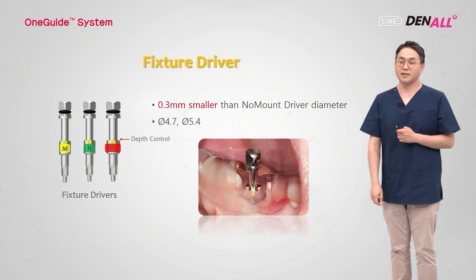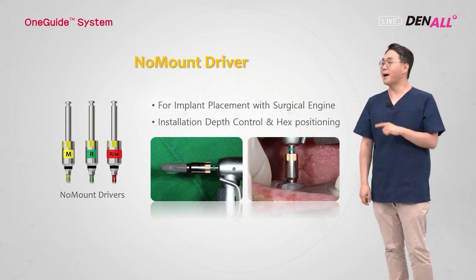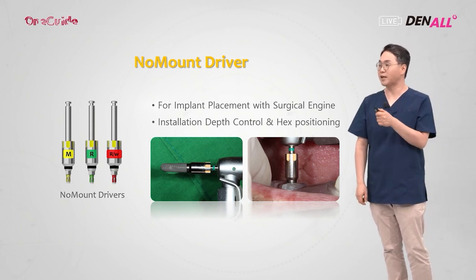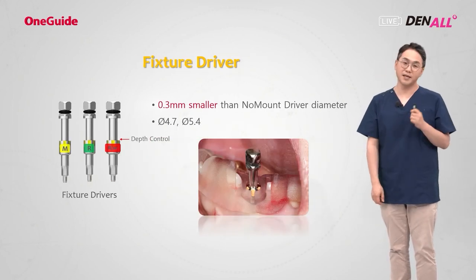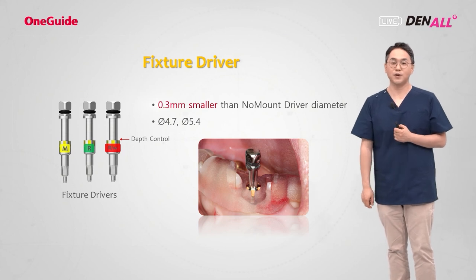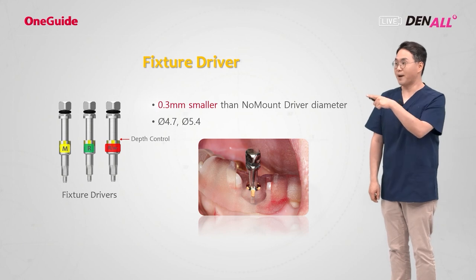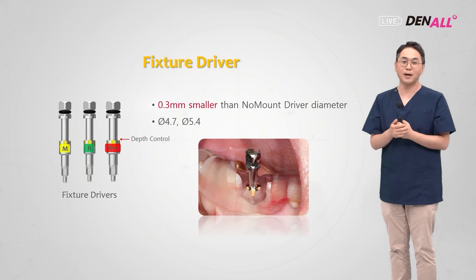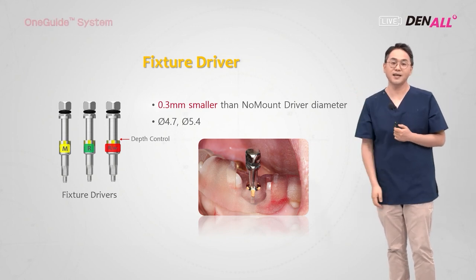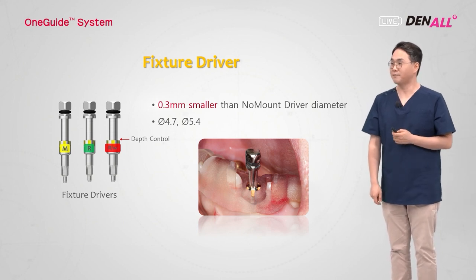To accurately place an implant, the no mounted driver should be used to place up to 50 to 80% of the implant length, and the rest can be placed with the fixture driver without jamming. If you place more than 50% of the length with the fixture driver, the guide hole and the barrel may not come in contact, then the angulation problem may occur and it will become less accurate.